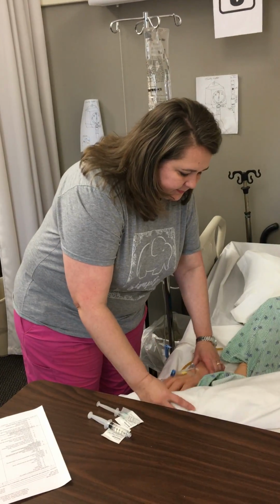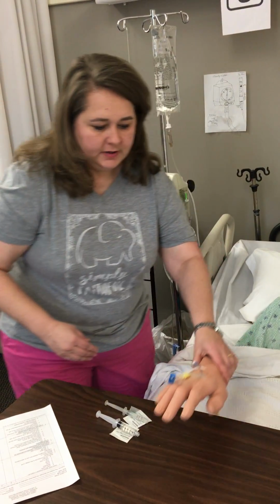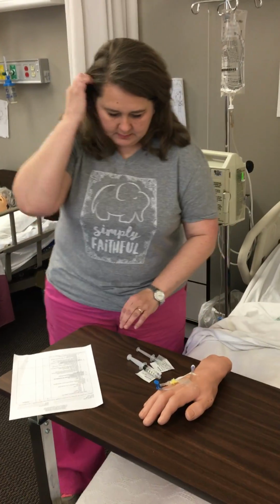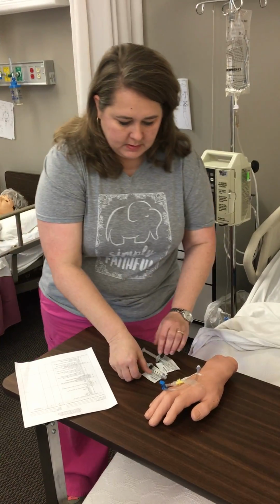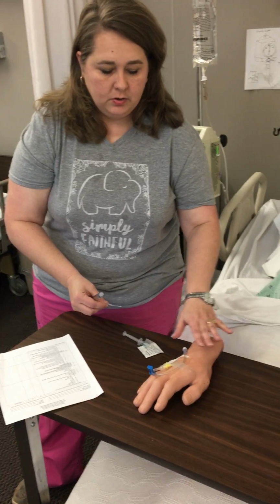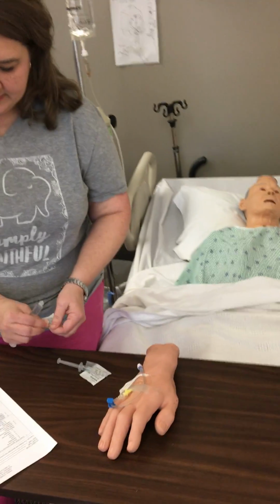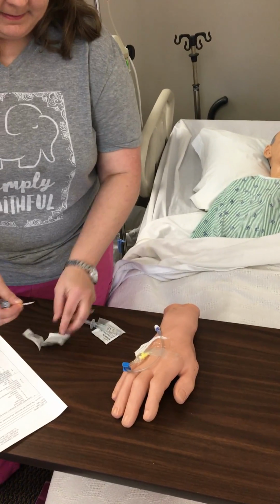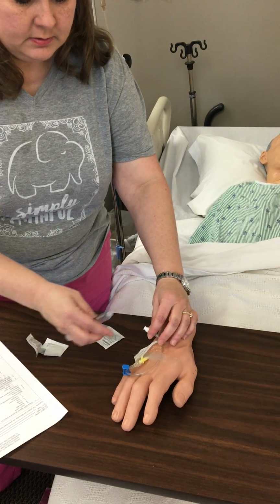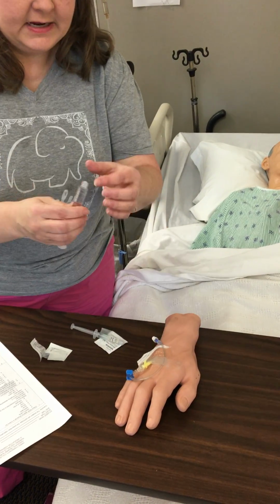Now also, at this point, I'm going to put this hand up here so that you can see what I'm doing. I want to assess my IV site to be sure that there are no complications, and there are none. I'm going to swab the port. I still have this clamped. I'm going to take off my cap.